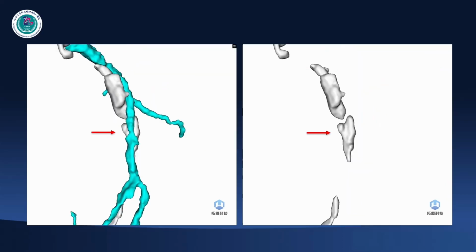Next. Okay, this time we delete the light blue LAD. We can see the distribution of the calcified plaque clearly, and we also could see the video of the live demonstration of the 3D reconstruction imaging. Next one. Next. Okay.